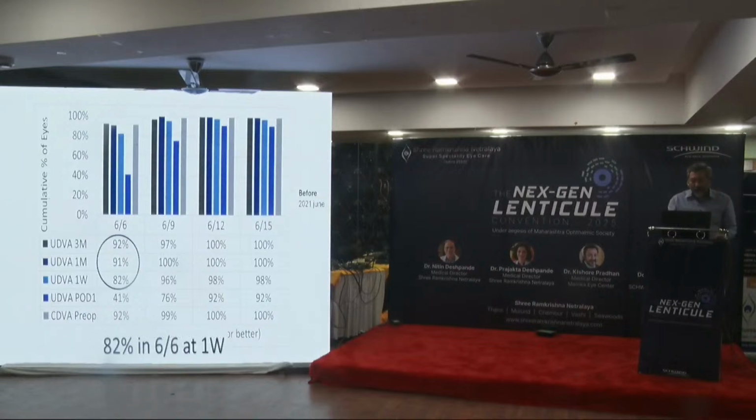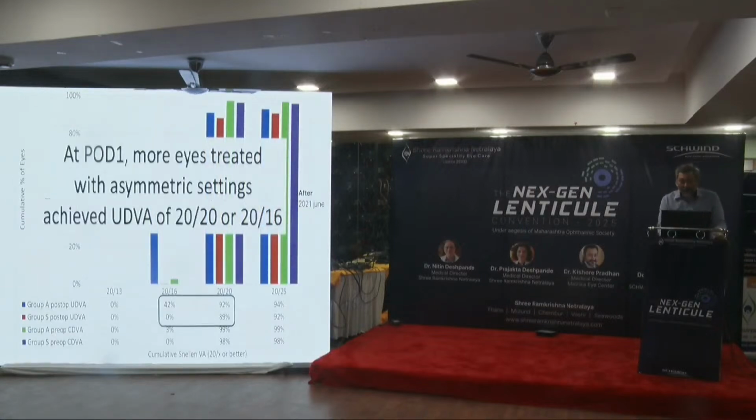We were very, very happy, we were getting like 82% for 20/20 in 1 week. And we were very happy. These are the normal results. But now our results, if you look at it, 42% of patients are 20/16. Many of our surgeons don't even dare to do LASIK in one eye and SmartSight or SMILE or whatever. But now the results are the same.